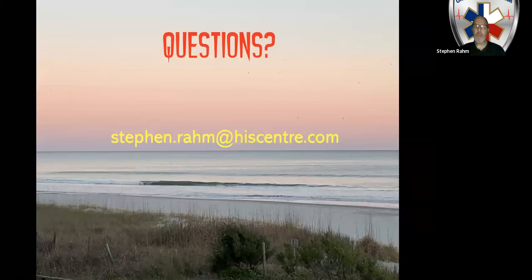So before we close out here again, I want to just reiterate a couple of points, okay? On the surface, when you're looking at a left bundle branch block, you can't call a heart alert, okay? And that has been established in science. However, if you don't know what a left bundle branch block looks like to begin with, then you're going to call a left bundle branch block a STEMI. So the whole point of this was to make sure that we are solid with our bundle branch block recognition, both left and right, but as it pertains to the screening tool and the reason for the number of overcalls, specifically left bundle branch block.